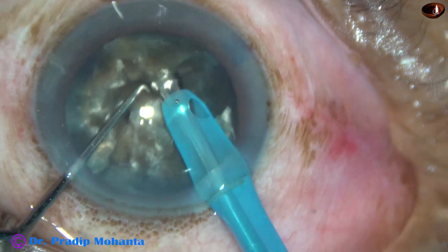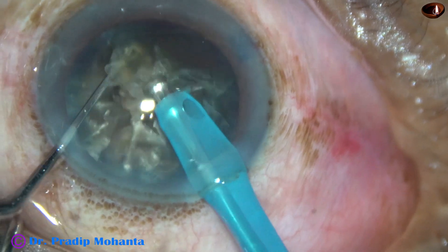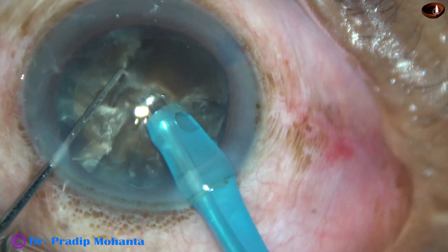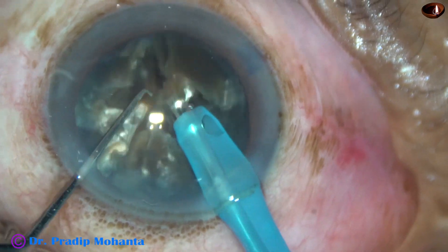Phaco power used is 80% in continuous mode. Flow rate is 45 ml per minute. Vacuum is 450 mm of mercury.